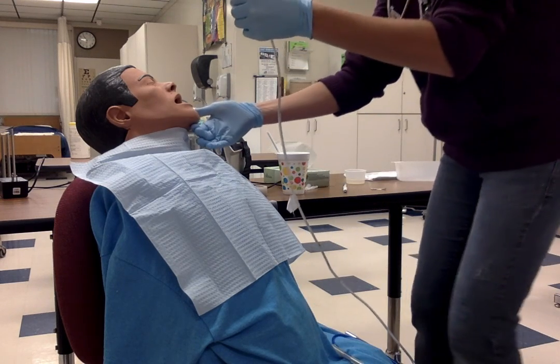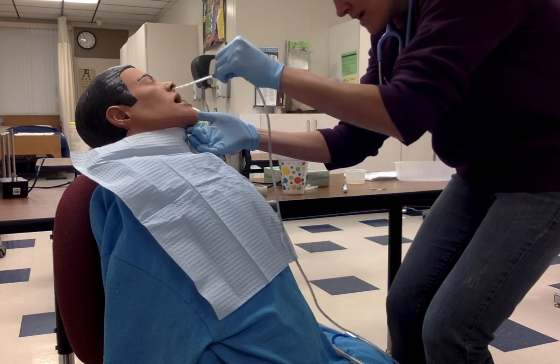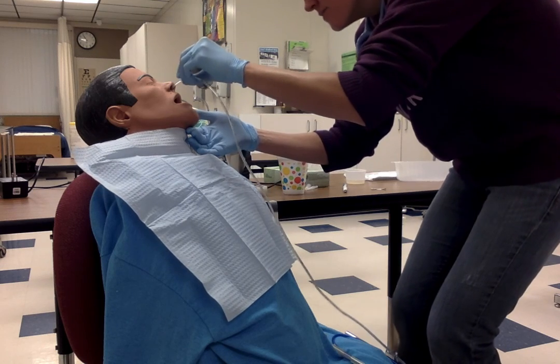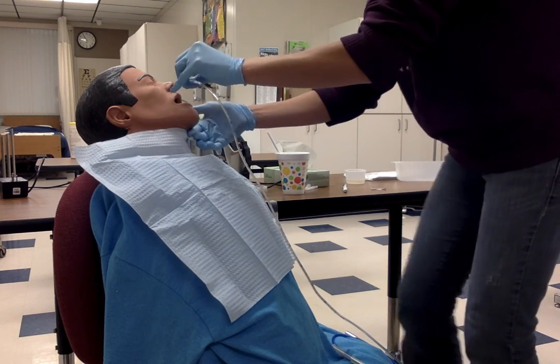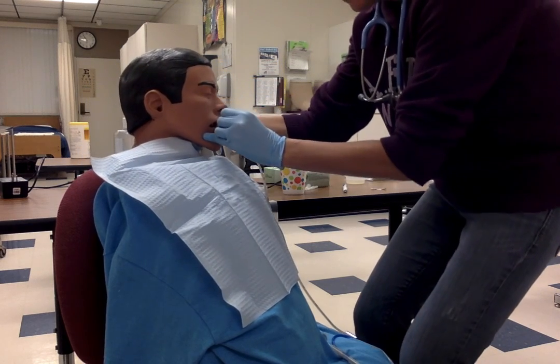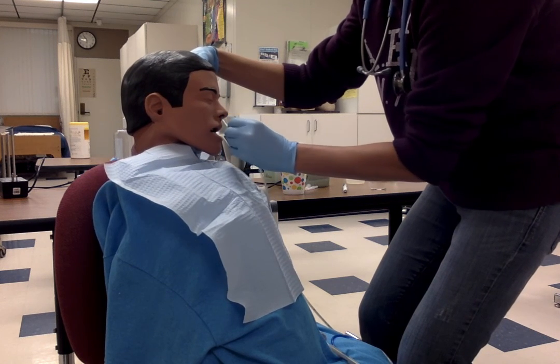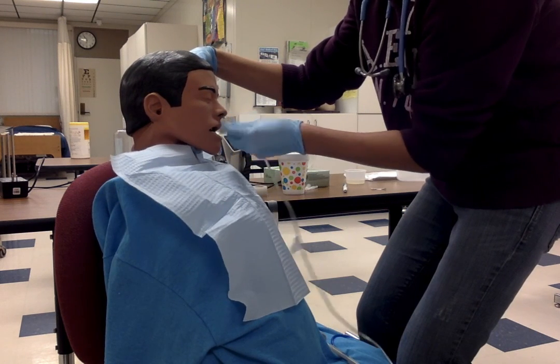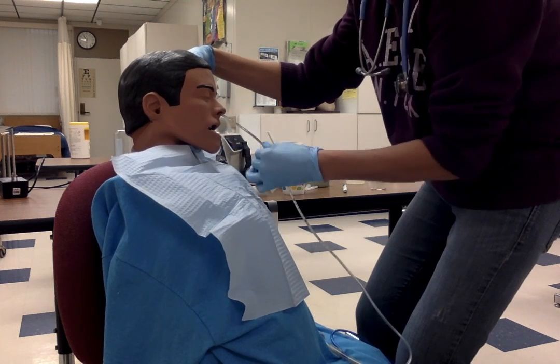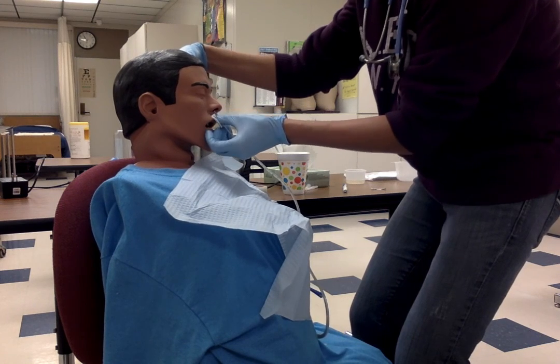All right, so we're going to tip up the head a little bit, and I'm going to insert just a little ways. And I'm going to go to the end of the throat there. Okay, so now the patient's going to tilt their chin down. And I'm going to have them drink, drink, drink. And I'm going to insert this. And it seems to be going very nicely at this point. And I'm going to go up until the tape.